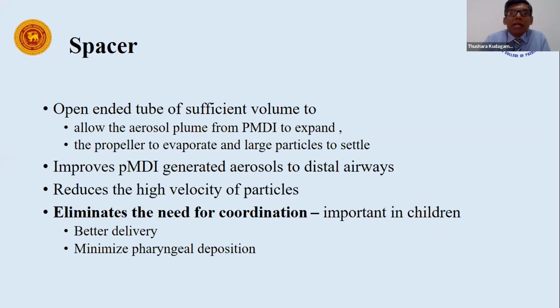So the large particles are left to settle on the wall, and it has been shown that this improves sending the medication to distal airways. And the most important thing about a spacer in children is it eliminates the need for coordination of the actuation and the inspiration. So that's why it's better to be used in children.